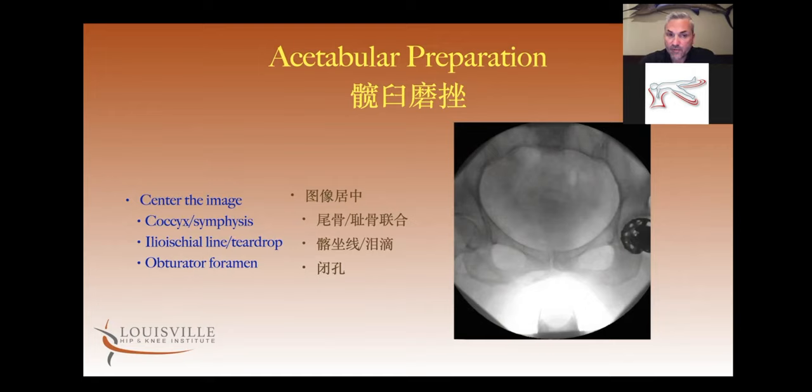The easiest determining sign that the pelvis is level is looking at the relationship of the ilio-ischial line to the teardrop. On x-ray, you can see the ilio-ischial line is lateral to the teardrop symmetrically on both sides. If my pelvis isn't level, I'll tilt the table a little bit one way or the other — I want my pelvis completely flat before I start to prepare the socket and put the component in. If my pelvis isn't flat, you run into similar problems as in a lateral position where you think you're placing the component correctly but because of the pelvic tilt, it's not.